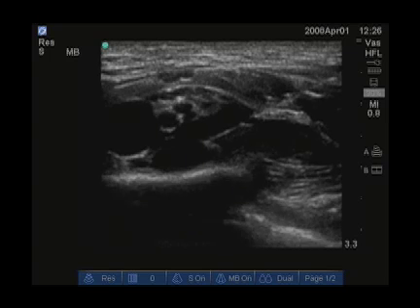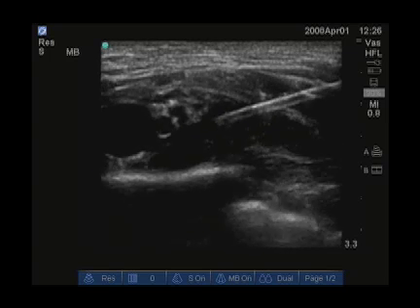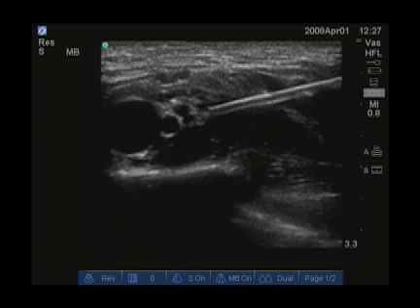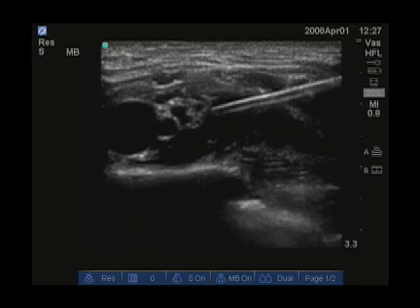As the injection is put into the pocket between the artery and the first rib, notice the artery is even lifted off the first rib during this injection. Now you can see the needle much better because it is at a flat needle angle. You can see the nerves just posterior to the artery and the hypoechoic local anesthetic spreading below the nerves.